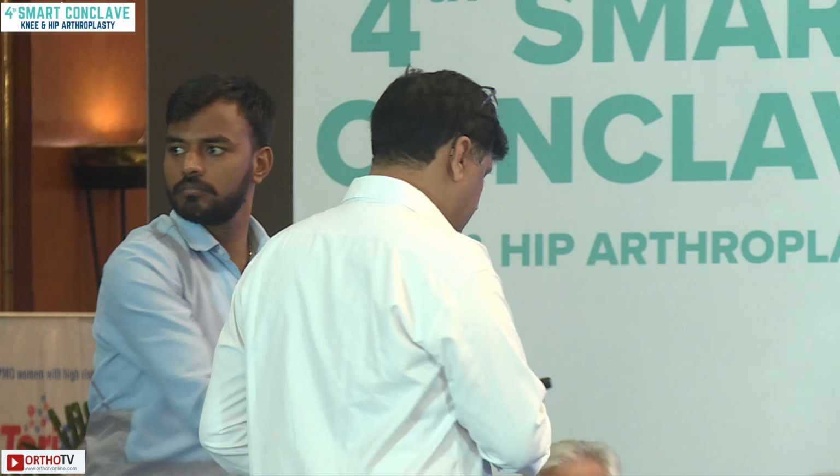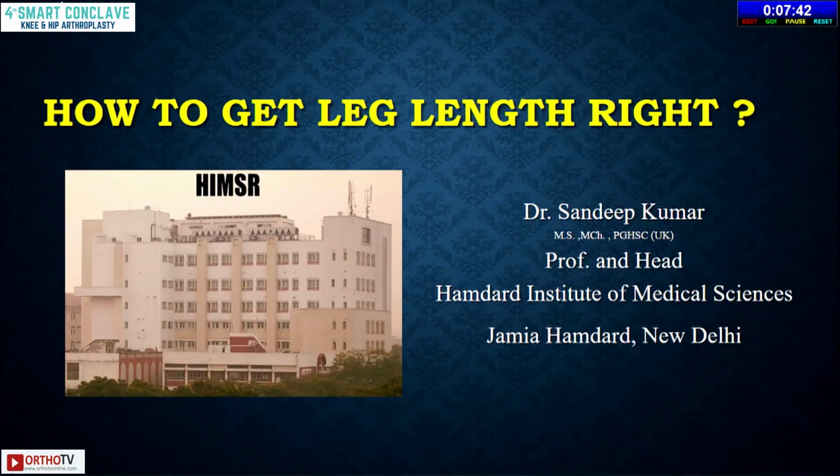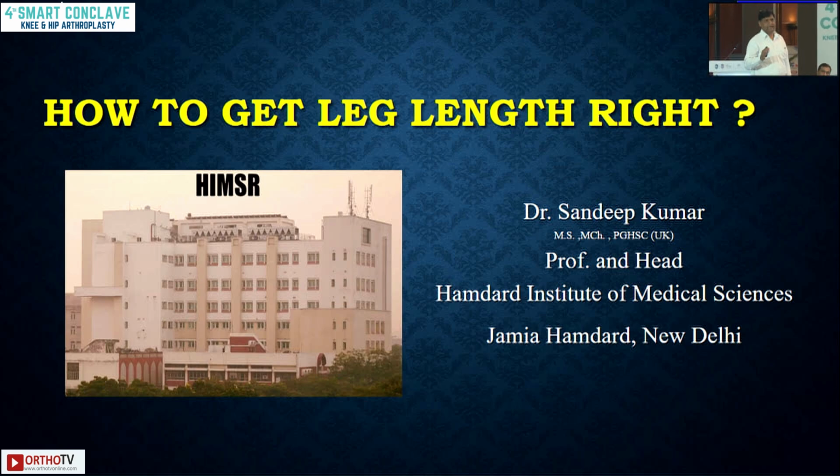My job has been made easier by Dr. Ashish, that templating is the key. If you are doing a hip replacement, you need to understand the templating. Because if you go in without templating, definitely you are going to land in limb-length discrepancy. So templating makes your life easy with that.